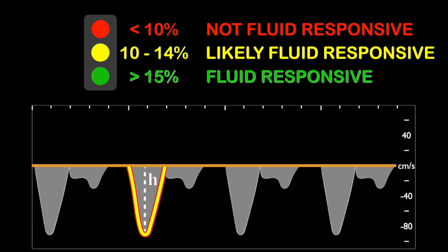What we find is that if we have a change of greater than 15%, that we have a very good sensitivity that they are going to be fluid responsive. And if, however, it's 10 to 14, it's a little bit less clear. They may or may not be. And then if they're below 10, they're absolutely not fluid responsive, and you need to look at other interventions to improve their pressure.